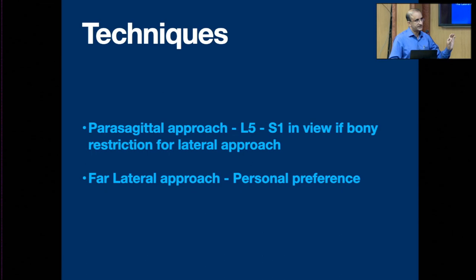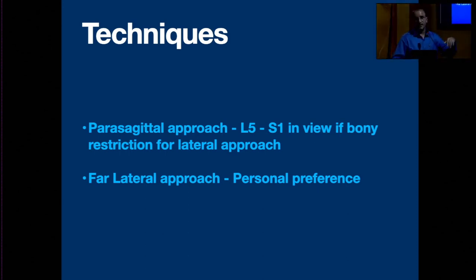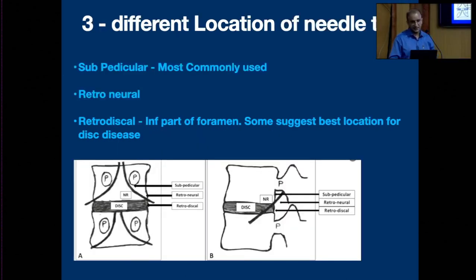The reason I do it is, for L5-S1, when I do endoscopic discectomies, I don't do a transforaminal discectomy because of the height of the iliac crest. What I do is an endoscopic interlaminar discectomy, where I don't need to drill the L5 lamina at all. There's quite a lot of space, and with a 6 mm or 7 mm endoscope, I can very well remove the disc. But higher up, when I do transforaminal discectomies, I use this far lateral approach so that I can negotiate the needle and my scope, which I'll tell you in detail.